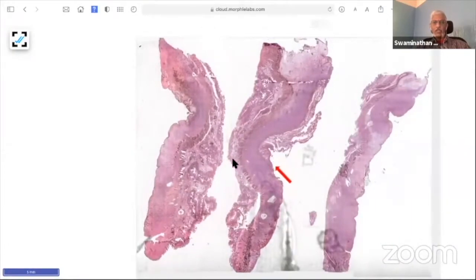And ischemic colitis, depending upon the layers involved, can be mucosal and submucosal ischemia or transmural ischemia. Here, this is the best example of transmural ischemia. And whenever you see transmural ischemia, 2 things are important. What causes this ischemia, and what happens to the margin? The margin has to be viable. If the margins are also showing ischemic change, call the clinician and tell them. Because of anatomic restrictions, they may not be able to remove the whole ischemic colon, but it is our duty to tell them.